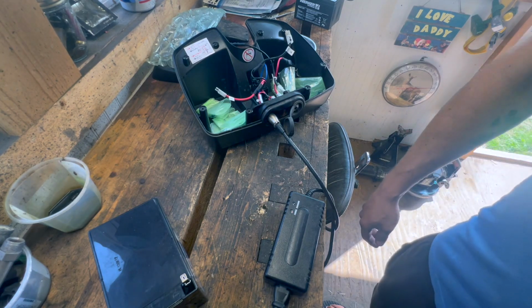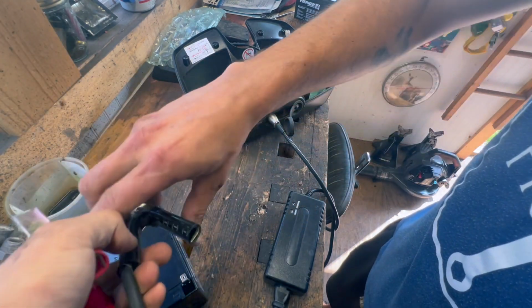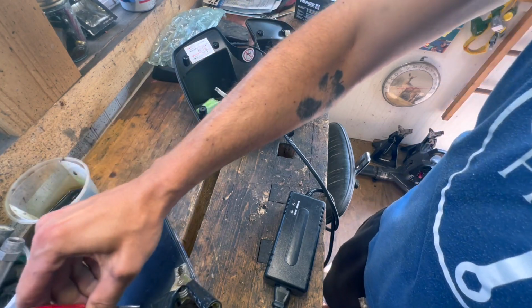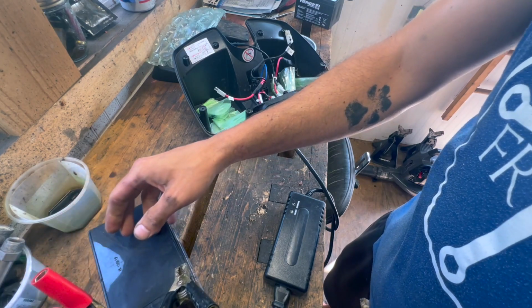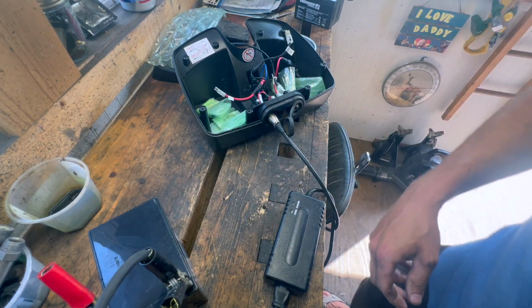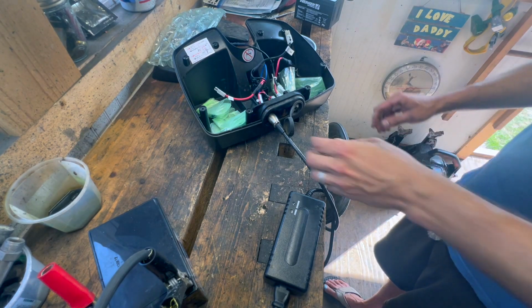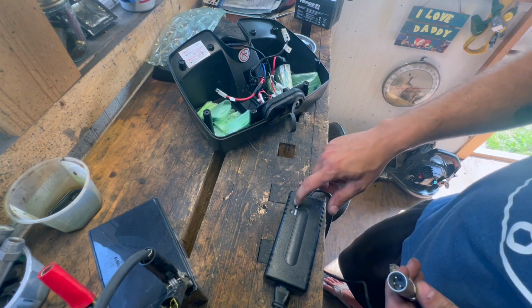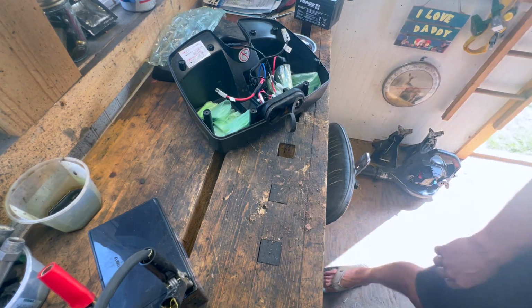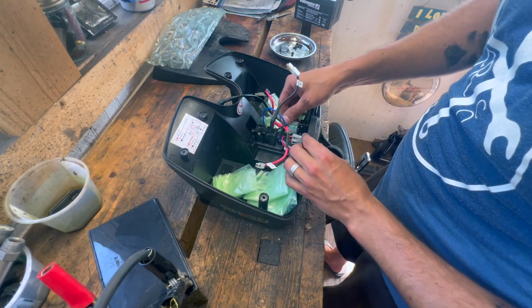I suppose for the time being, I can hook these up to my battery charger, since they are 12 volts. And we'll see if we can kind of charge them manually. It's also very possible that this light is just burnt out, but that seems like an unlikely issue.